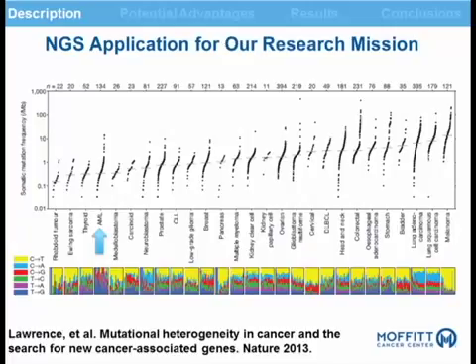So why are we interested in these targeted NGS panels? The reason, I think, is summarized nicely in this slide from Lawrence et al. What I'd like you to focus on is the relative genetic homogeny of acute myeloid leukemia, and by extension, the rest of the myeloid malignancies. Compared to carcinogenic tumors like lung cancers and melanoma, AML and other myeloid neoplasms have relatively few driver mutations that in part can be captured by a myeloid panel like the one that RainDance offers.